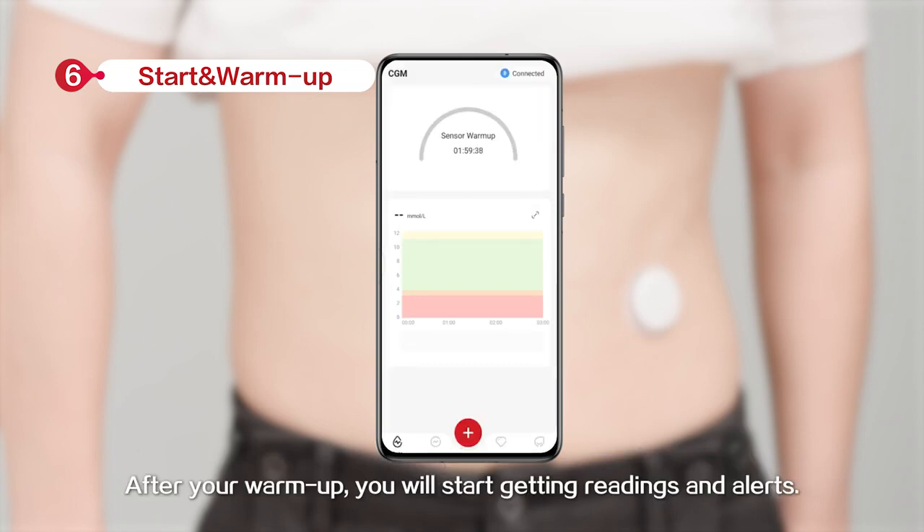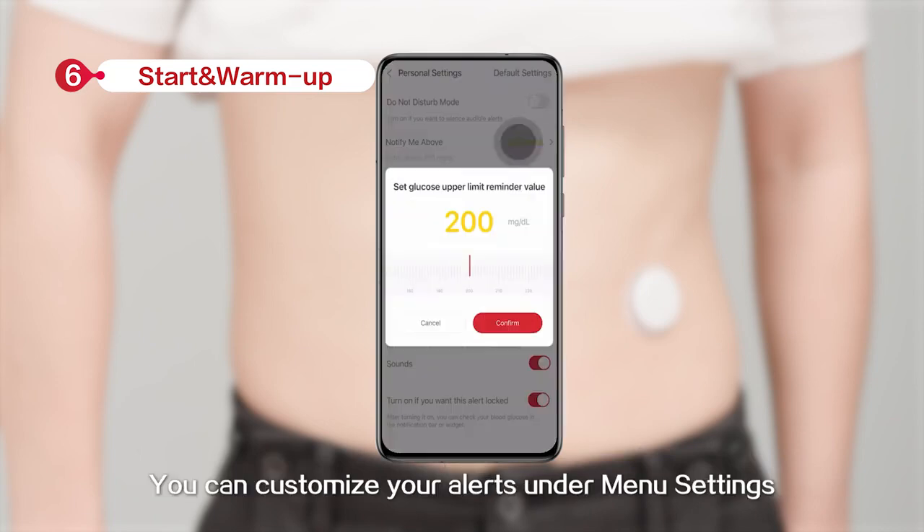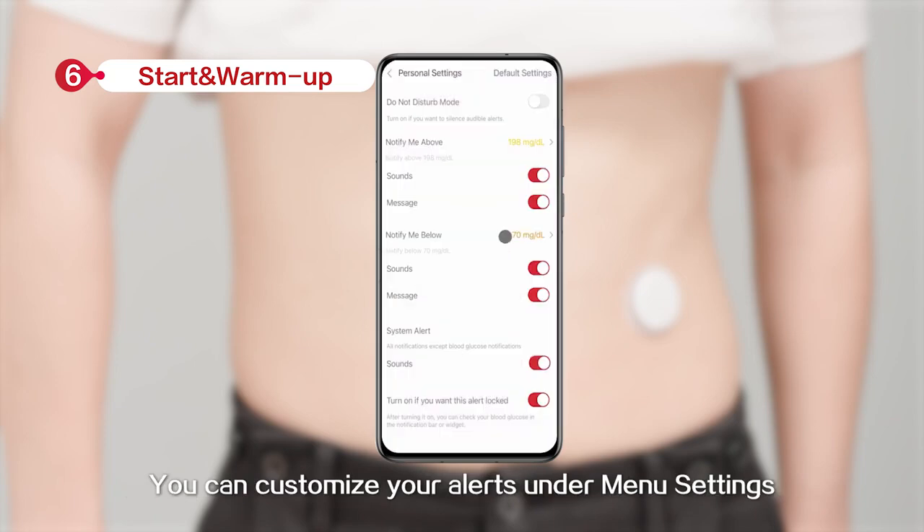After the warm-up session, you will start getting readings and alerts. You can customize your alerts under Menu Settings.